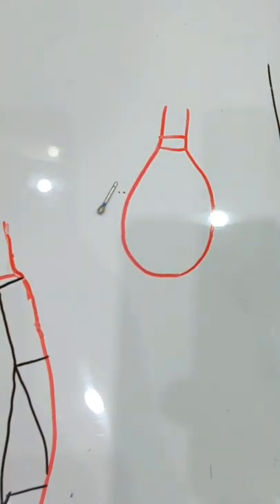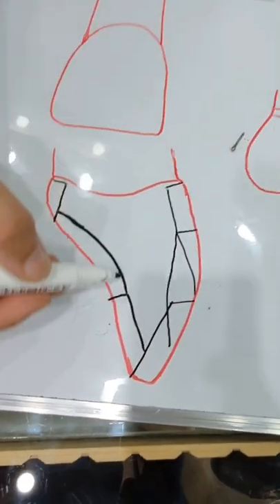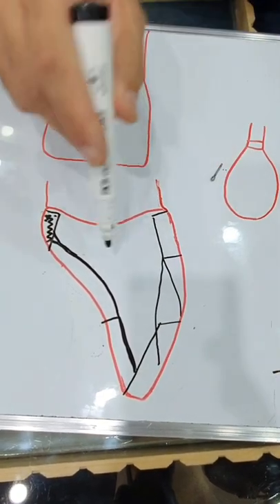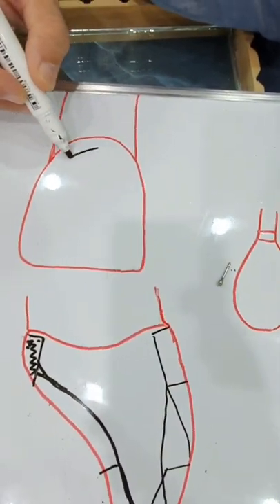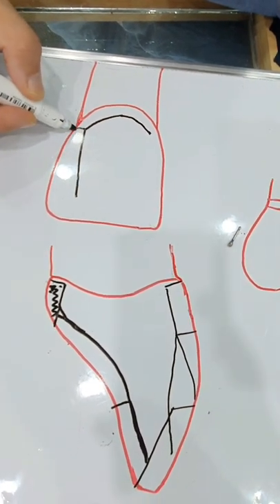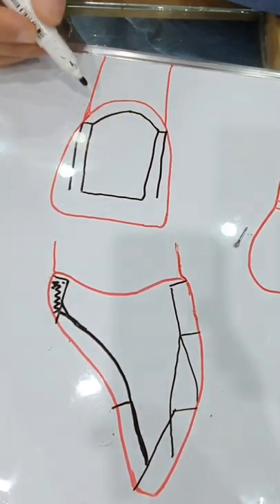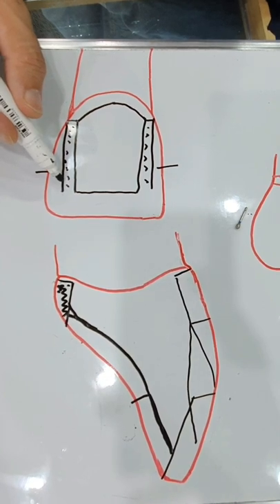I would use that burr and I would create in one sweep a nice round curvature on the lingual aspect. This works great, and I would even extend it all the way to the incisor, and the only area I would leave would be this area right here, and I would finish that with my shoulder prep burr, and that's how you get the crown prep done right. When you look at the facial aspect of it, I follow the same principle. I would do the margin first on the facial, then I would do the lingual, and interproximally I would connect them together, and this would leave a sliver of the tooth structure against the adjacent. And as you're doing this prep right here, the adjacent area remains protected, and this will be the final prep. This is the shape of the burr, and this area is the tooth structure that remains between the tooth you're prepping and the adjacent tooth.